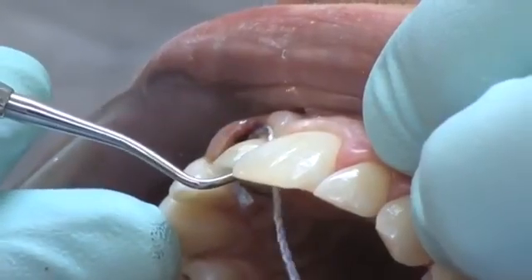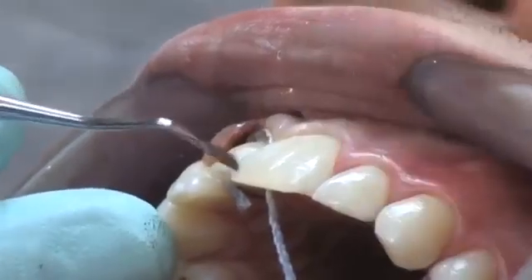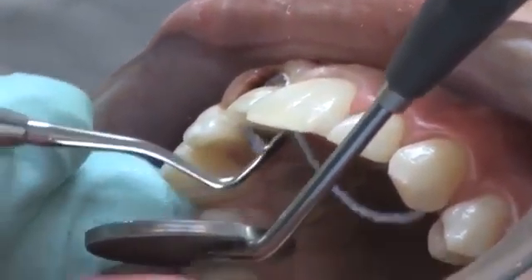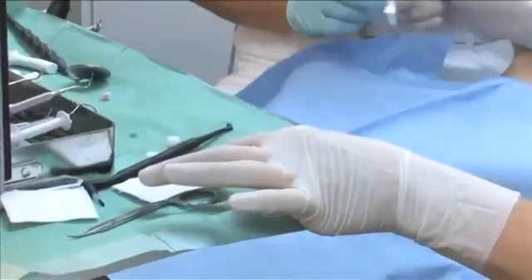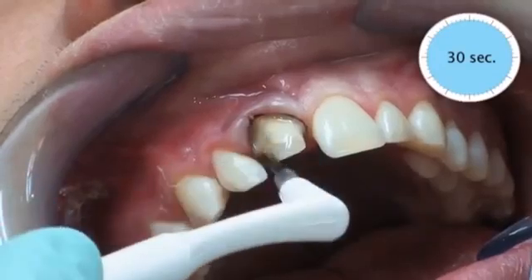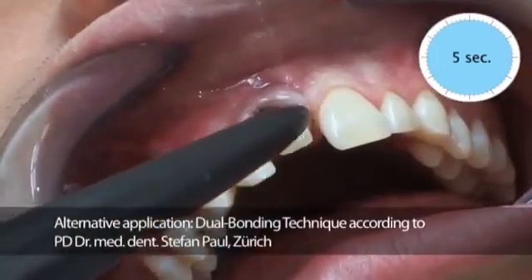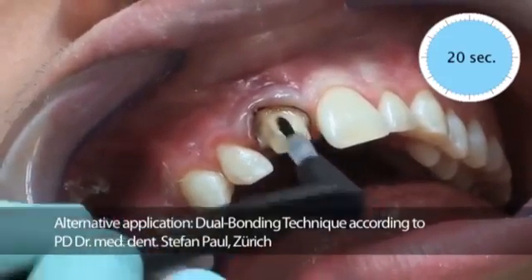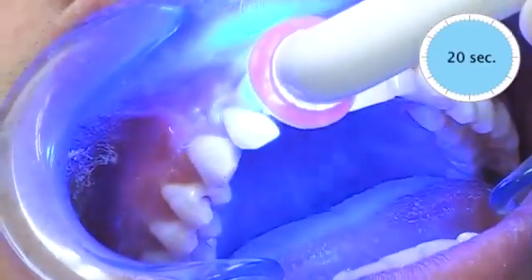Atraumatic compression of the gingival tissue is performed before the final impression is taken using a suitable retraction cord, such as Compracord, with a stable structure and a high absorption capacity. Application of a multi-component bonding system, such as ART bond, before the final impression seals the dentin tubuli and increases the retention of the restoration. Dr. Paul describes this as the dual bonding technique. The oxygen inhibition layer must be removed afterwards, leaving no residue.